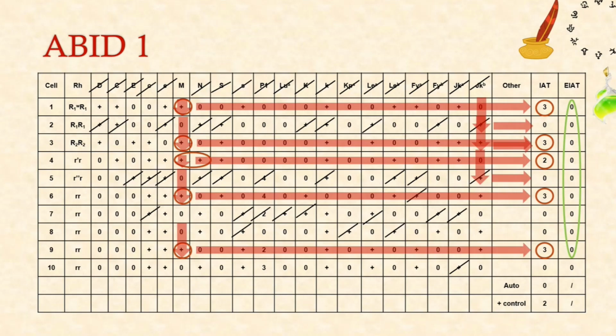And then this one here, I just want to draw your attention to, because anti-M can actually show dosage. So here you'll notice that this is classed as a heterozygous cell because it's M positive and it's N positive, and N is its antithetical antigen, which is like its little friend. And you've got a weaker reaction there. So they are things that you can sort of pick up. And sometimes with a weak expression of anti-M, it might even miss the heterozygous line. So that's almost just a sort of double check with just watching the strength of your cells.